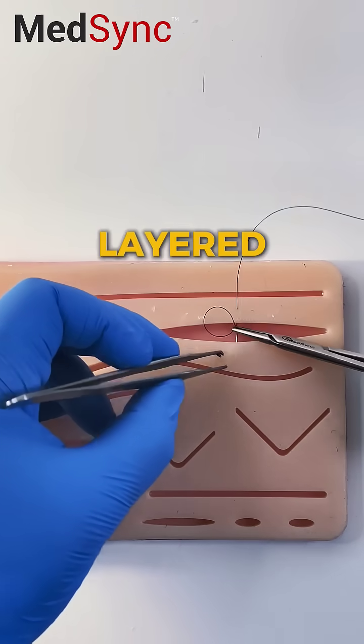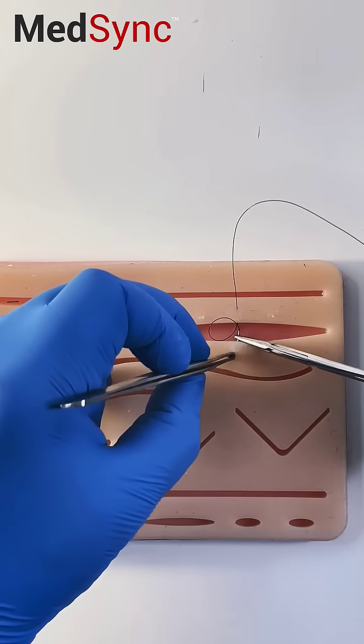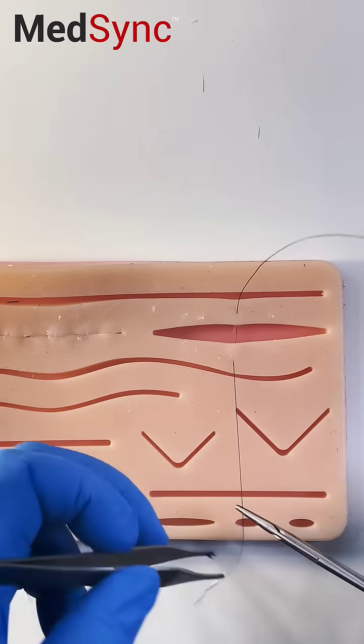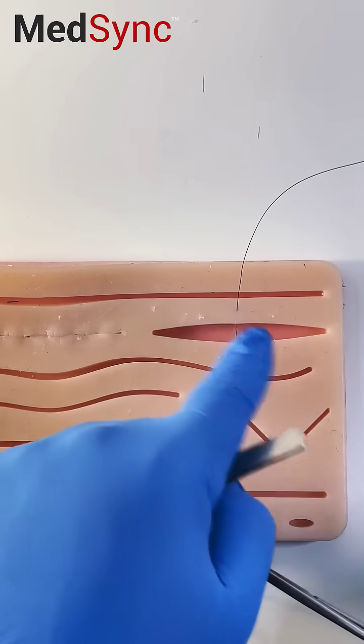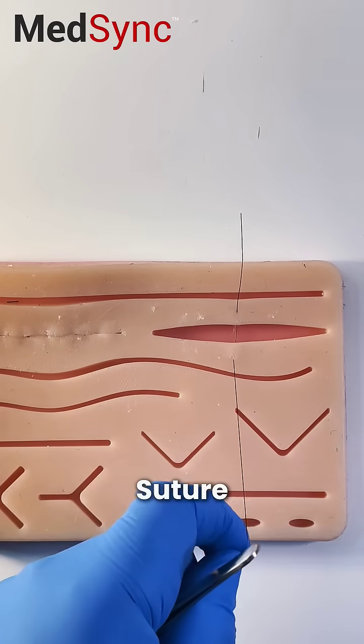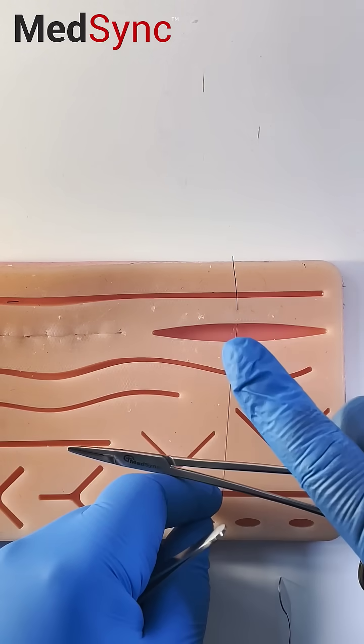You need to do a layered closure because the wound edges are far apart, but if you start with the deep dermals they'll probably just rip out. So we're going to do a tension alleviating suture, which is an interrupted suture but like a pro.